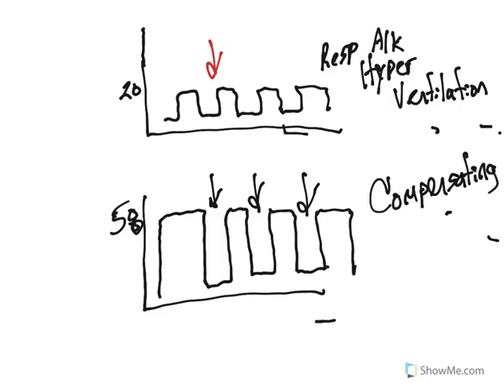My hope is that eventually those waveforms will start to become normal waveforms, okay? Because this patient is actually compensating for that acidosis.